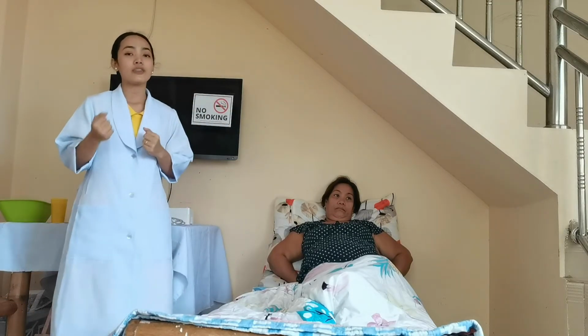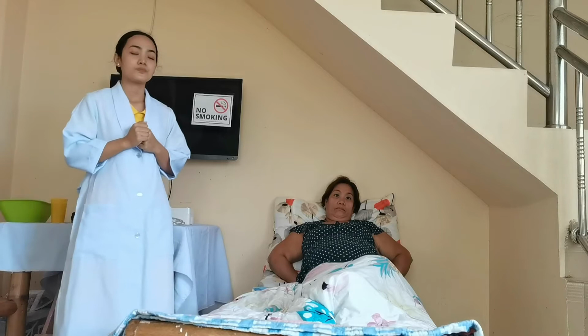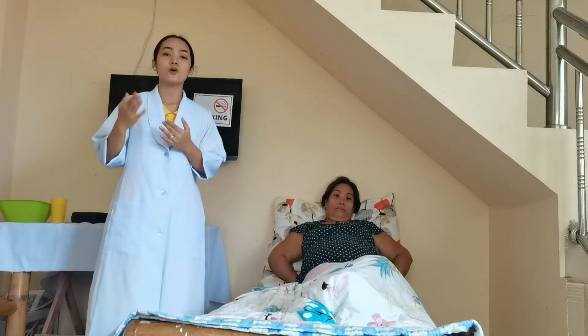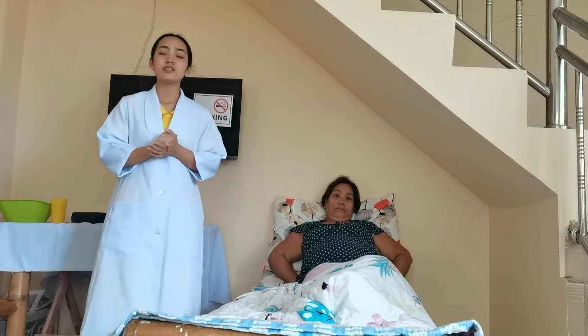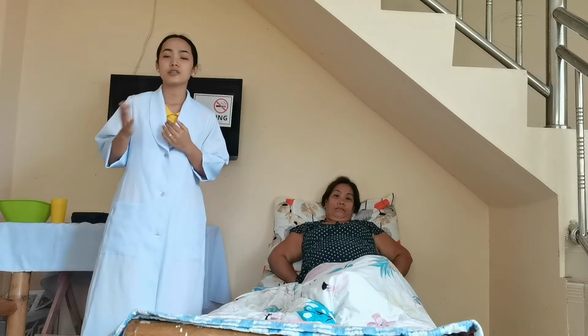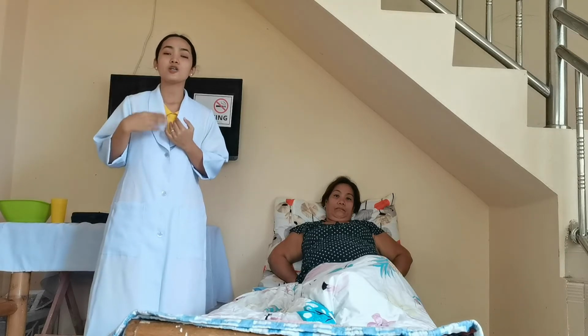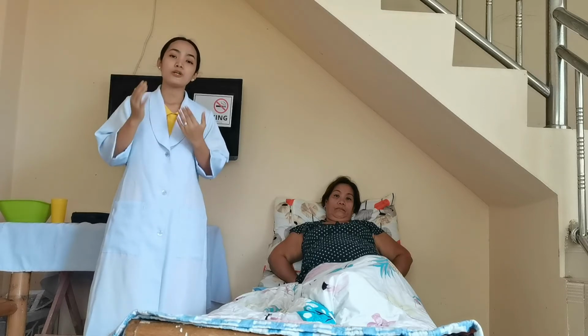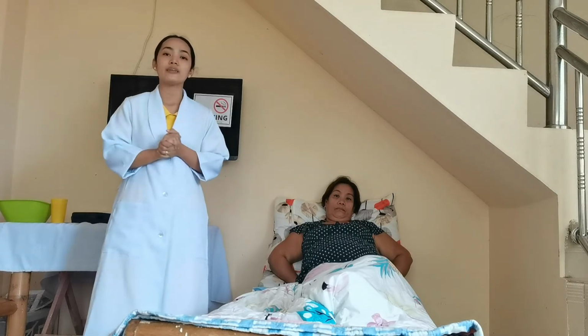So first, we need to identify the doctor's order to prevent errors. We also need to know if the client has allergies. And then as nurses, we need to know special nursing considerations, the action, purpose, and side effect of the medication, and the safe dose ranges for our prescribed medication and for the client as well.